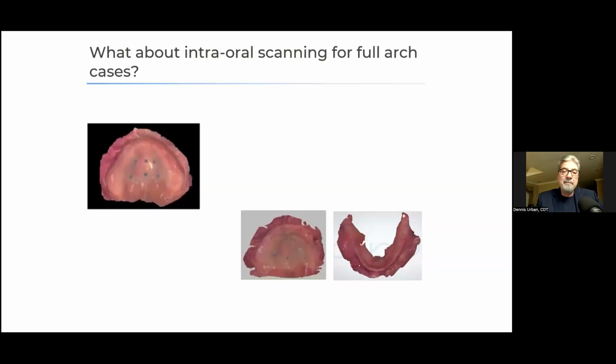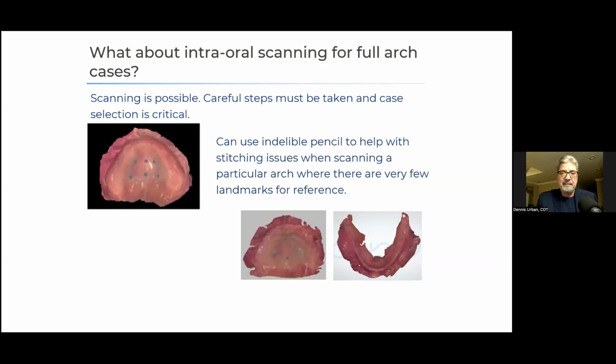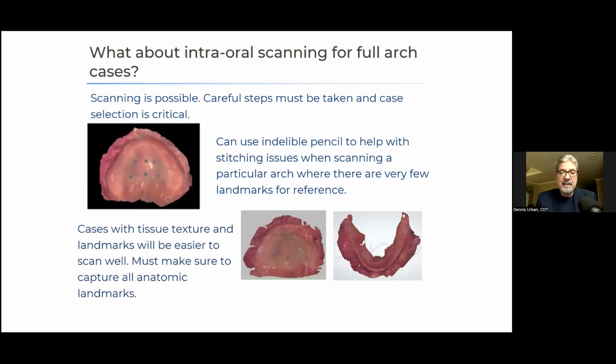So what about intraoral scanning for full arch cases? Well, scanning is possible, careful steps must be taken, and case selection is critical. You can use an indelible pencil to help with stitching issues when scanning a particular arch when there are few landmarks for references. That helps, but cases with tissue texture and landmarks will be easier to scan, and we want to make sure all anatomical landmarks are captured. So it's still a challenge, scanning fully edentulous cases intraorally and capturing all those landmarks.